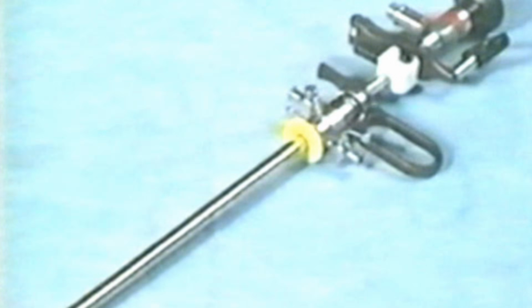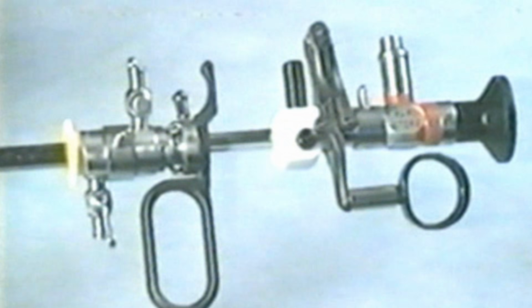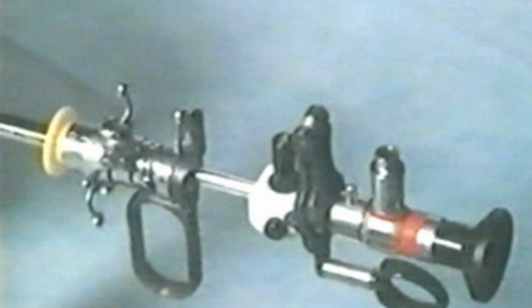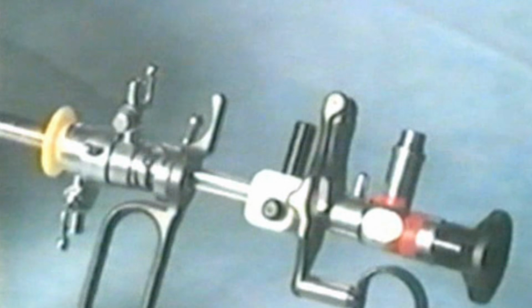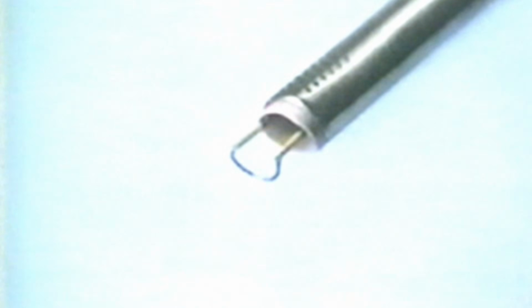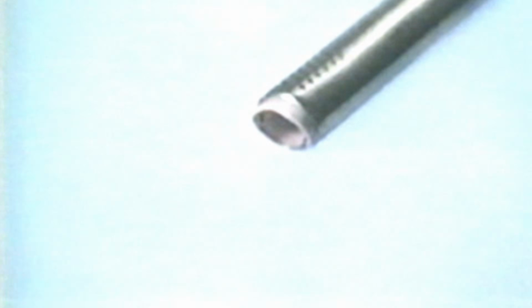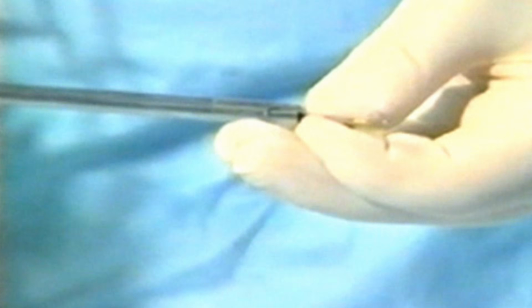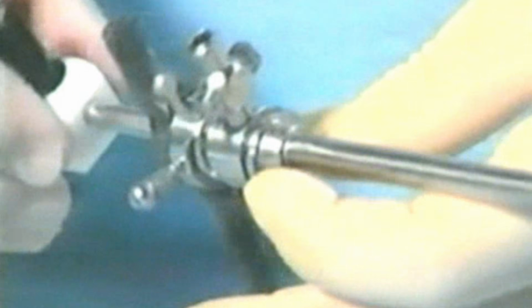Now this is the resectoscope, which is made up of 5 important things you assemble together, and then it is called a resectoscope. What are the components of the resectoscope? Already we know there are 5 components: first is the telescope, second is the outer sheath, third is the inner sheath, fourth is the working element, and fifth is the electrode. First you put the electrode in the working element, after that you put the inner sheath and fix it. After that you put the outer sheath.